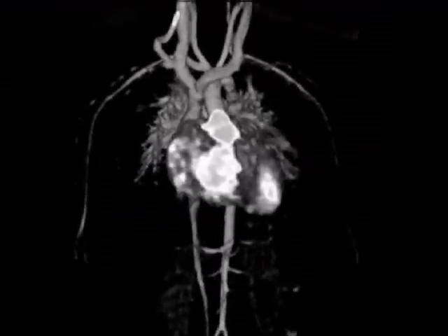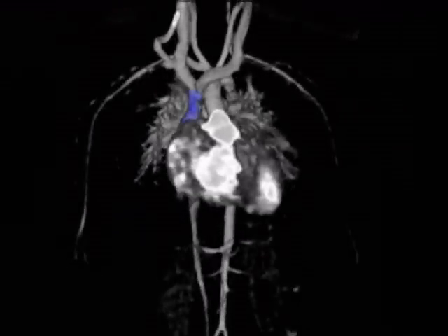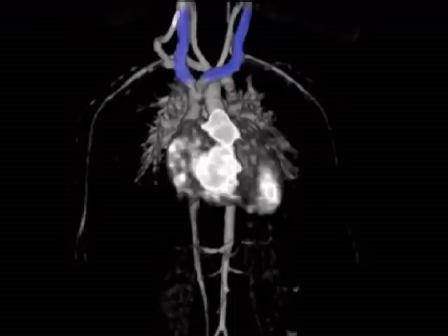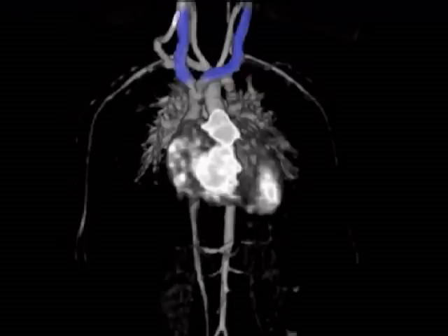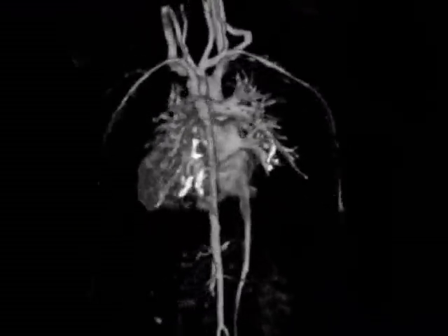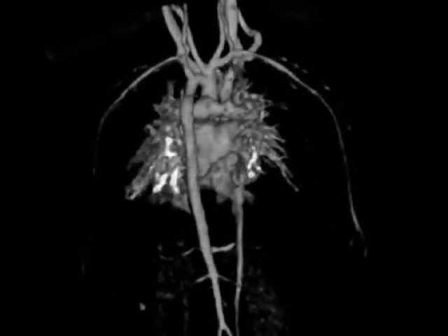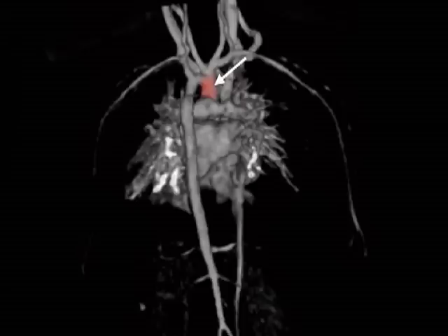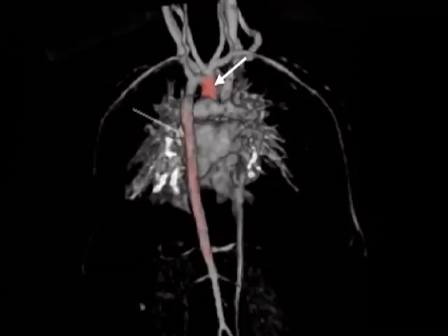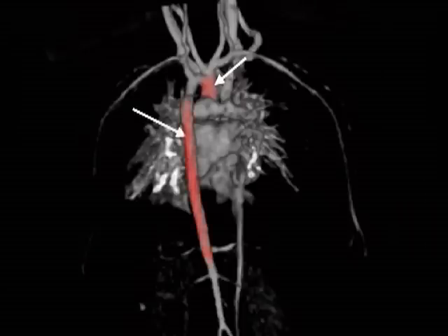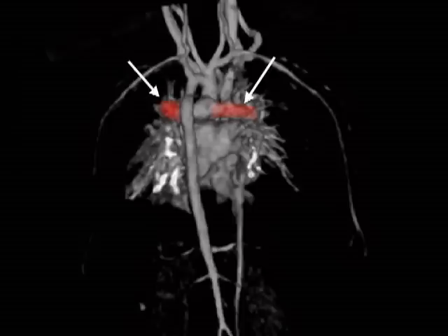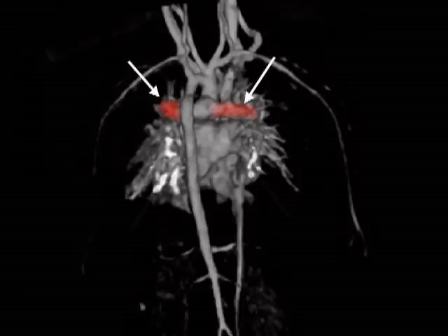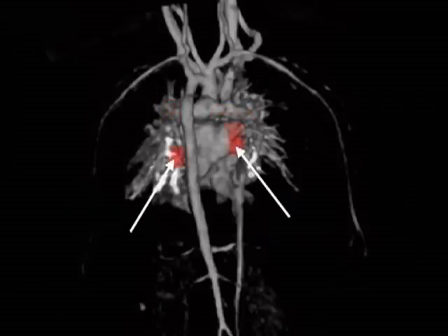Clearly visible in the dataset is the vena cava superior and connected veins. In this view, the arrows point to the ascending and descending aorta, the right and left pulmonary arteries, and the right and left pulmonary veins.